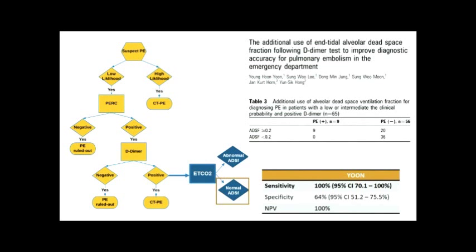The alveolar dead space fraction, you have to look at, is this a validated means? How accurate is it to compare it to your arterial CO2? And did they comment on the types of PEs that the patient have? No, they don't. So it's not meant, but I think this is quite interesting, because this would, if replicated and validated, be a way to actually obviate the need of a CT.